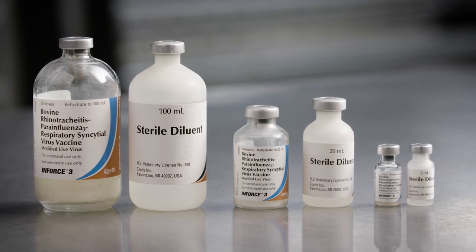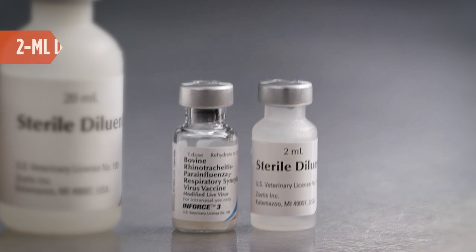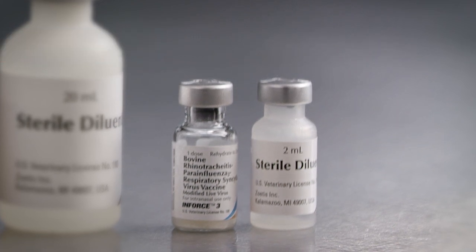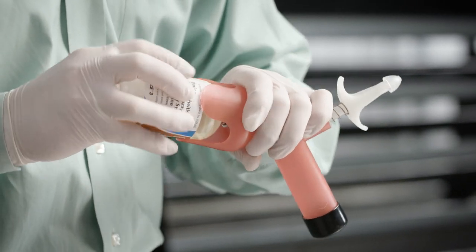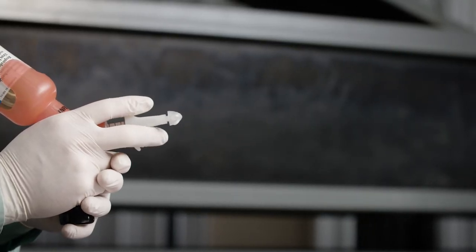The dosage for INFORCE 3 is not dependent on the size of the animal. Therefore, all animals, regardless of weight, should be given a 2-milliliter dose into one nostril. INFORCE 3 can also be administered with a pump-it device by placing a mixed 50-dose bottle in the slot and pulling the grip up to administer the vaccine.